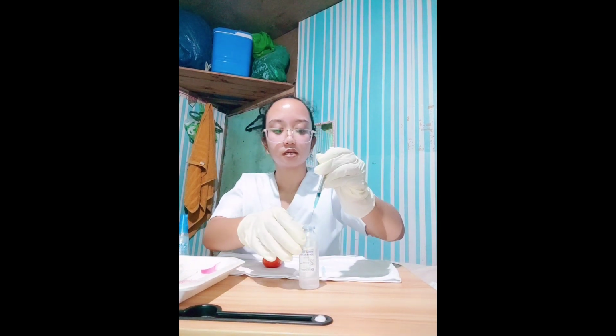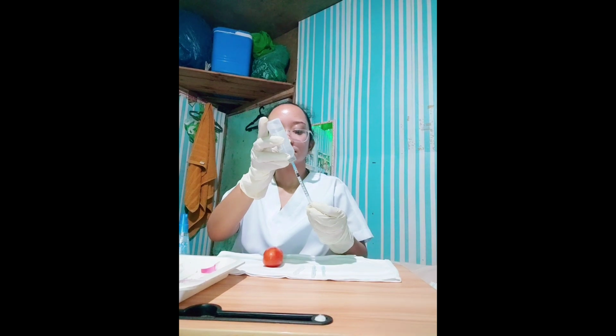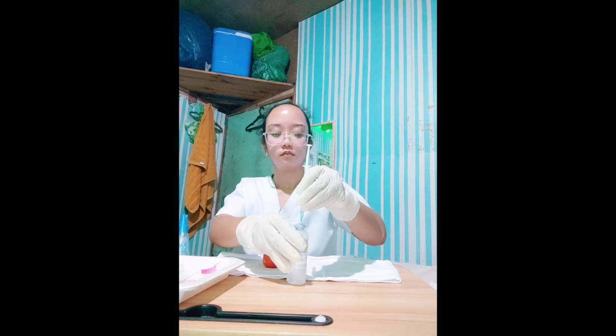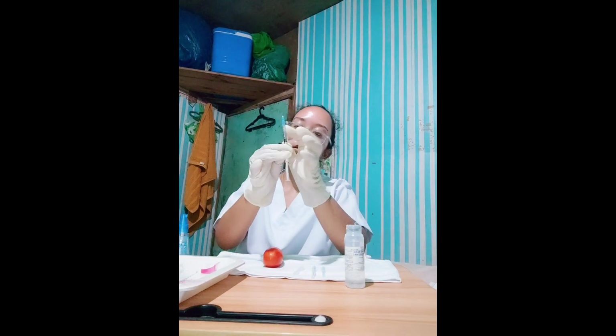So when we are injecting intramuscular, we will inject the intramuscular at a 90-degree angle, and we will remove excess bubbles.